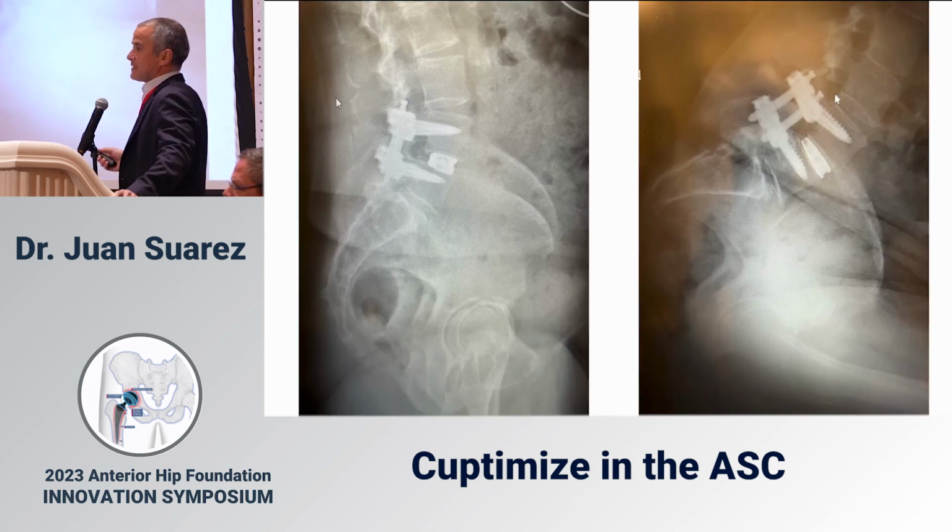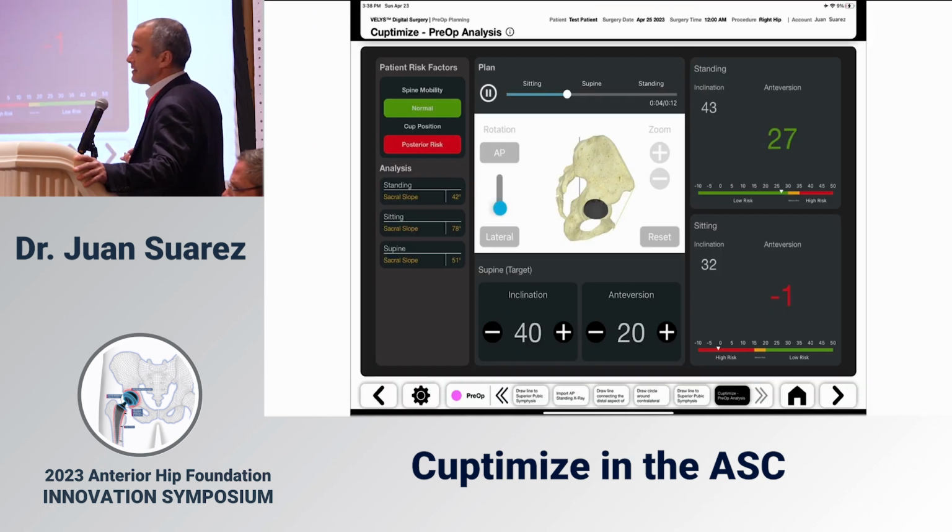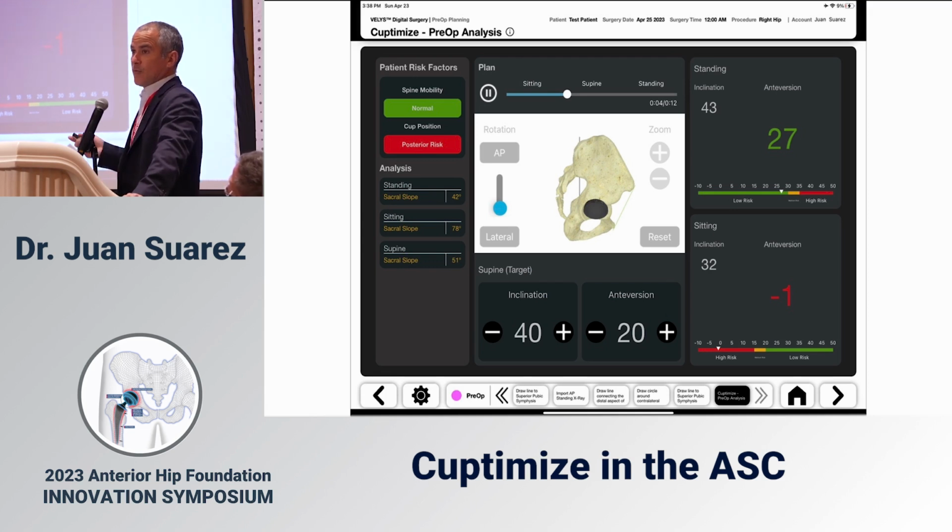But look at this now. If you get a forward flex seated x-ray on this guy, it rolls forward a lot. And if you run the analysis, if you put that cup at 40/20, you have no anteversion when that patient is rolling forward in a seated position. I don't know the answer of where to go here, but I'm looking at that and I'm going to throw in a dual mobility just in case, and I'm going to do it at 40/30 in the standing position. So again, it gives you information that we may want to know or we may not want to know.